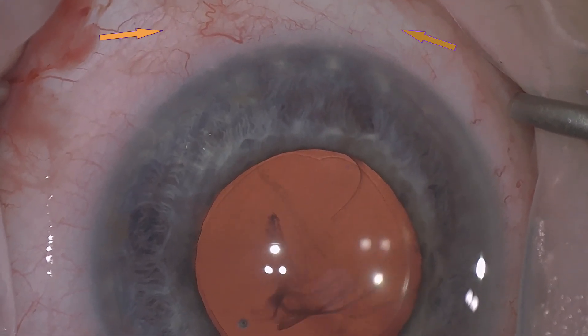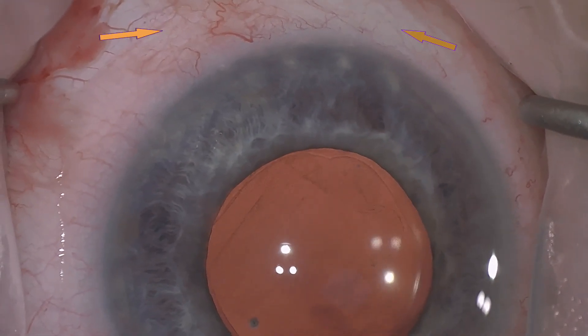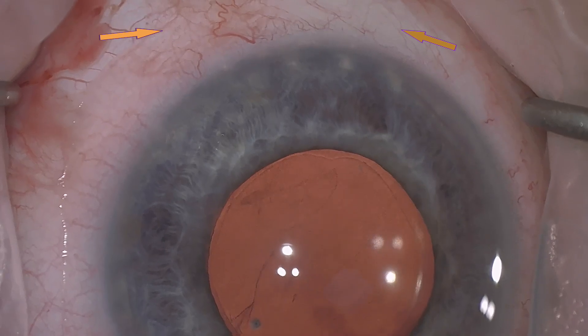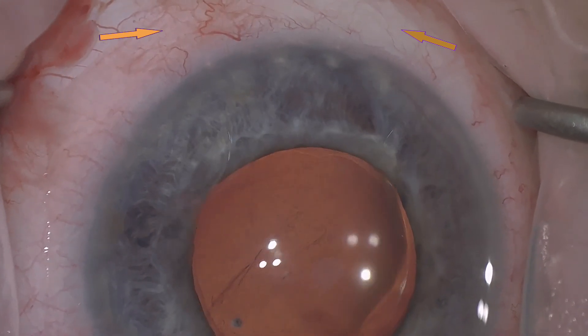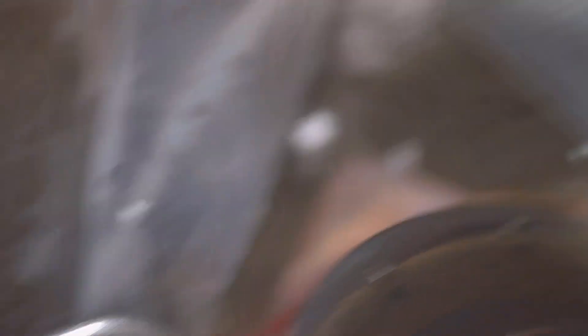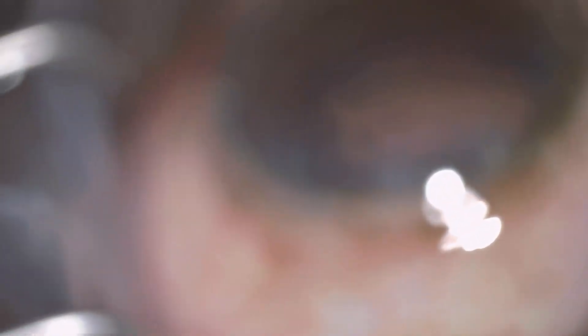is excellent reflux of BSS into the distal outflow. So now this next case is of an African-Caribbean patient with advanced glaucoma and cataract. And the cataract surgery has been completed. And we're now securing a view of the angle.